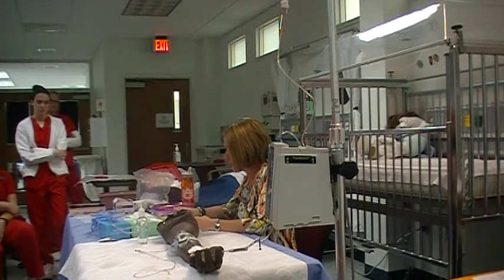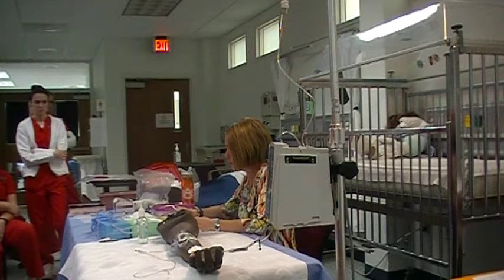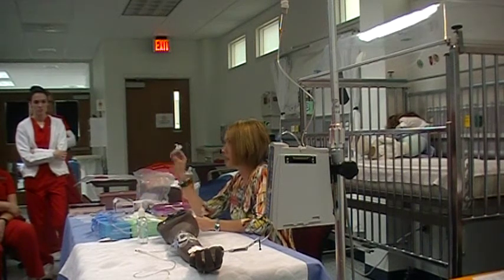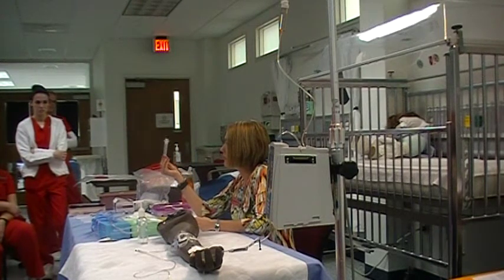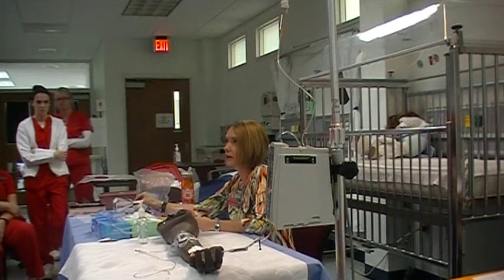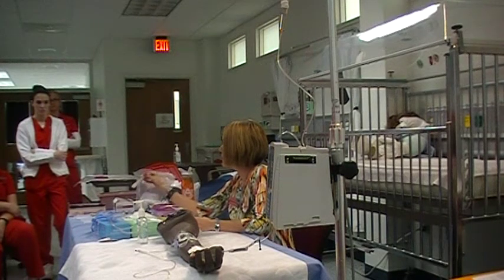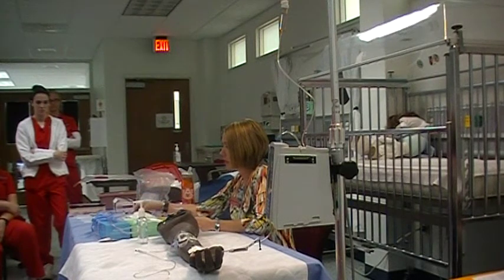You're going to apply clean gloves. Of course, we're washing our hands. You want to make sure you have 2 of your normal saline vials. And then once you've drawn up your medication, you're gonna label it, so we know what we've got. Because a lot of times, if you mix something in a 10 cc syringe or 10 ml syringe, once you grab your tube, we don't know which is which at this point because they're all clear. So just make sure that when you're done drawing up your medication, you go ahead and label that.